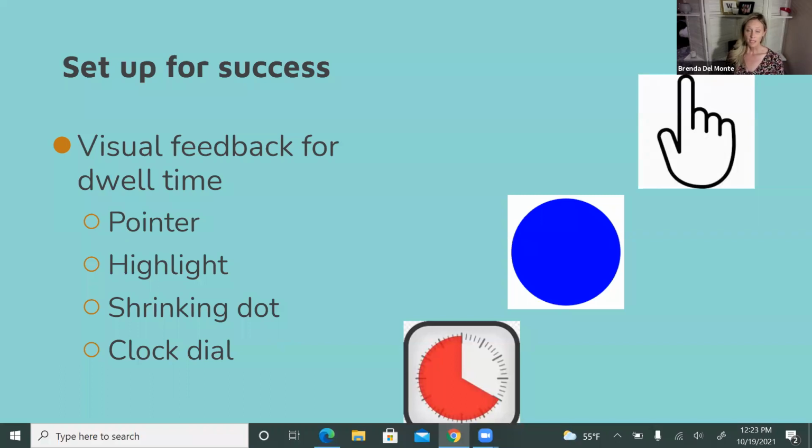The problem is he played the video and then he's looking at it. So then it pauses the video and plays the video and pauses the video. So under assistive touch, you'd have to set it up to pause with my eyes and things like that, which for my users who are 5, 6, 7 years old is a little bit cognitively challenging. So I'm on the fence on whether or not. It seems like the child has to be extremely still. And Nigel from Inclusive TLC says it really doesn't work well with glasses, and he wears glasses.